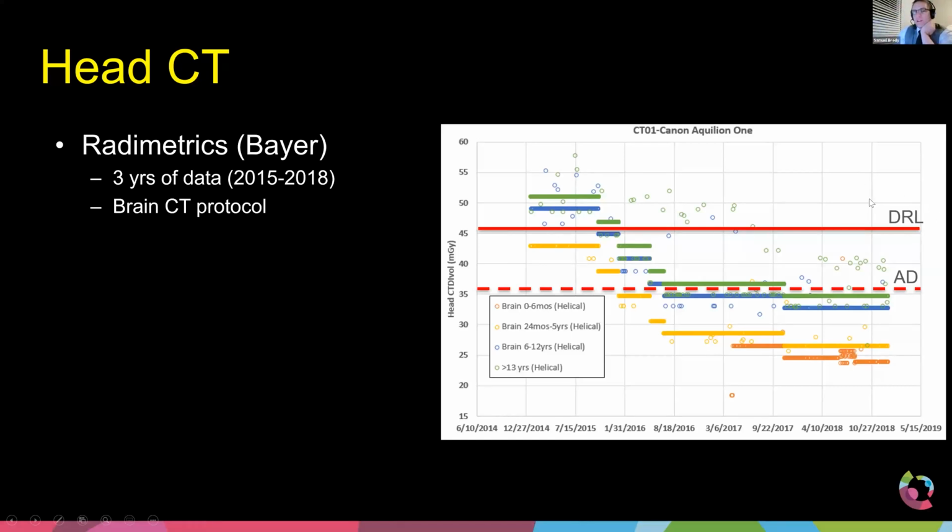a pediatric DRL. When this occurs, when you actually draw that line, the DRL line, and then you start looking at your protocols above and protocols below, we realized we didn't feel comfortable with that. We looked at the image quality and we realized there's good image quality. Obviously, everyone's happy with that. But could we do as well below this line?